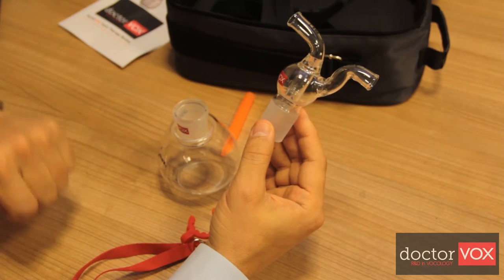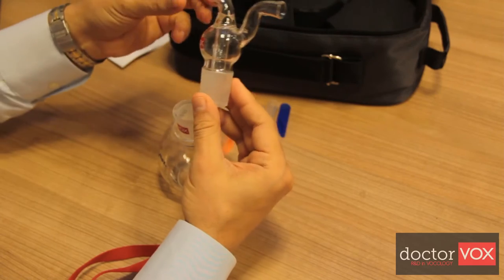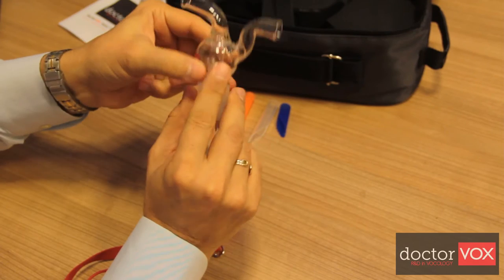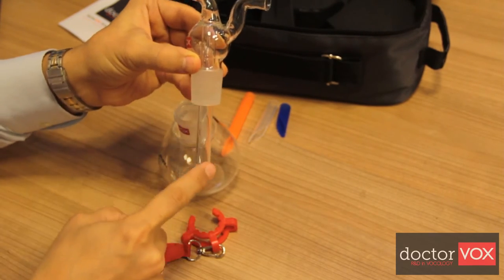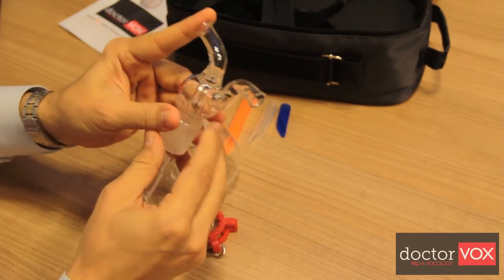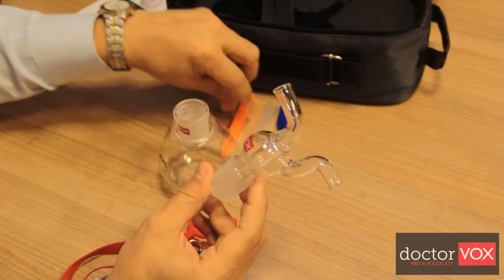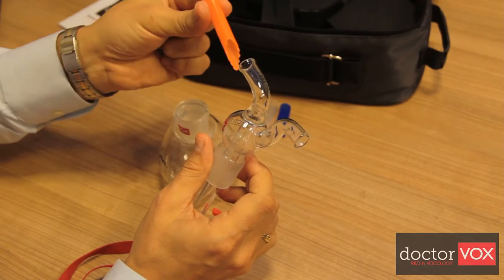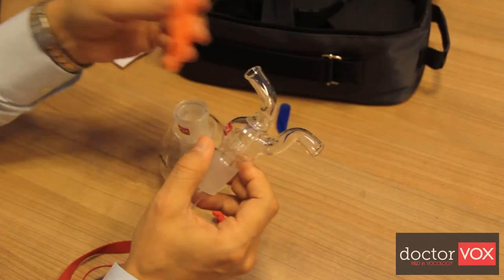Dr.Vox is formed by two parts. The upper part of the device is basically formed by two tubes mounted one inside the other. The inner tube is for blowing and phonation. The active length of the inner tube can be adjusted individually for the user's vocal tract length by this silicone mouthpiece, which is colored orange, in order to form the standing waves in a natural manner.